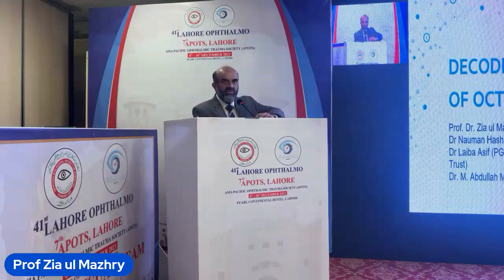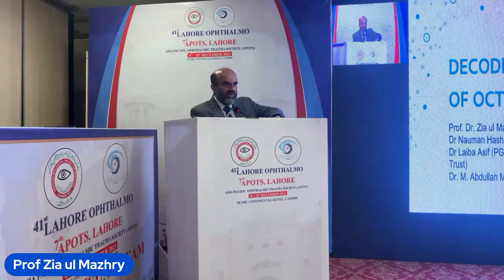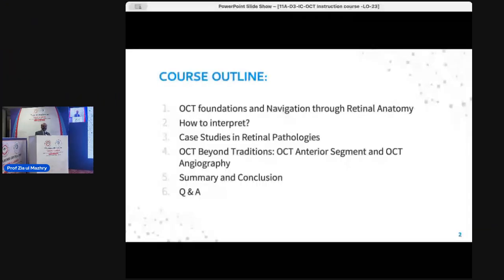I welcome you here in this exciting diagnostic ophthalmology session, decoding the secrets of OCT. And we start the session with basic concepts and correlation of the histopathology of the retina with OCT. And we welcome chairman of the session, Dr. Sharif Hashmani.